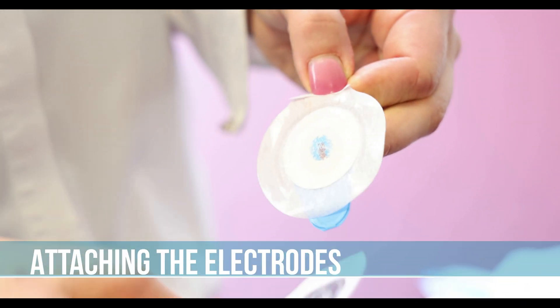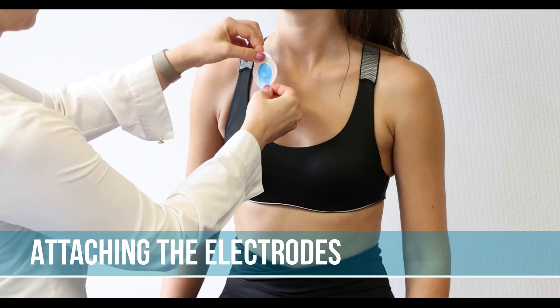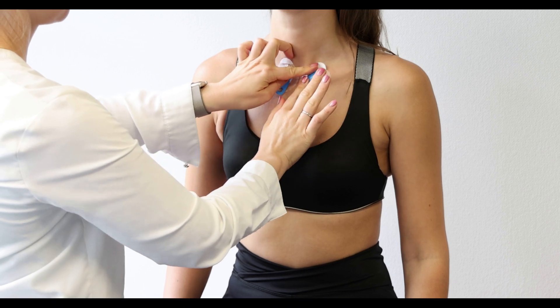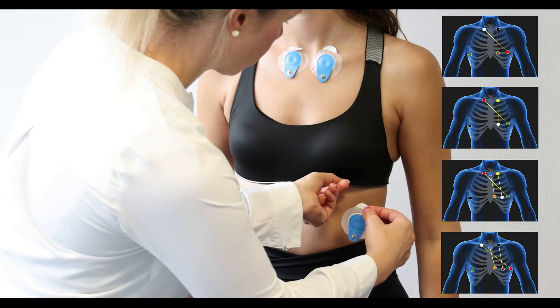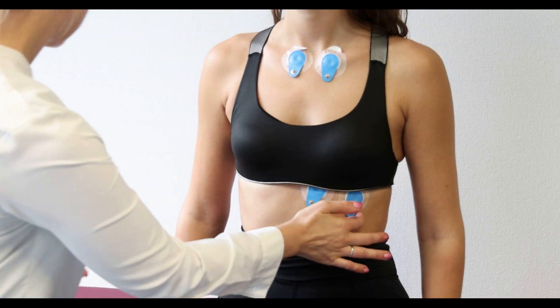When placing the electrodes, make sure that they are not positioned on the pectoral muscle. Instead, place them on the collarbone as this reduces the resistance of muscle artifacts. Remove the protective liner and place the electrodes according to the electrode placement, which varies depending on the cable type. Make sure the electrodes are firmly in place by pressing them onto the surface after placement.